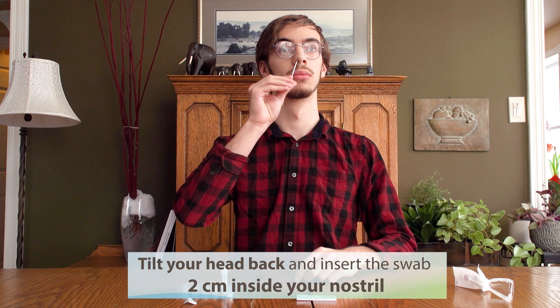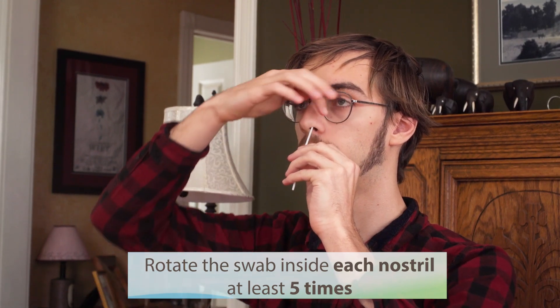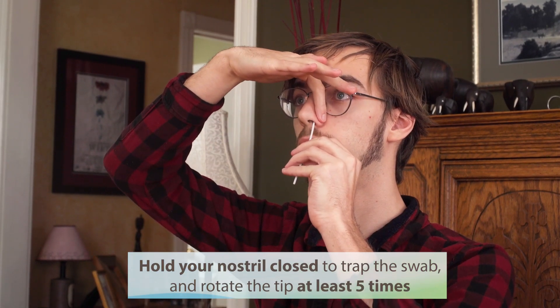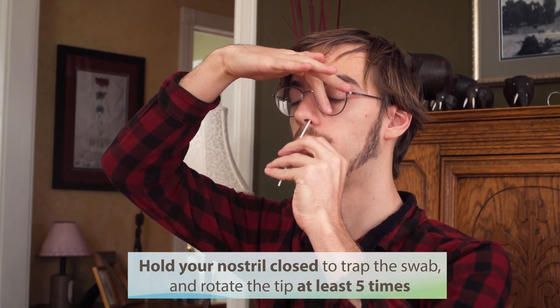Using the same swab, tilt your head back and insert the swab two centimeters inside your nostril. Rotate the swab inside each nostril at least five times. Now hold the nostrils closed with your fingers to trap the swab and rotate the tip again at least five times.